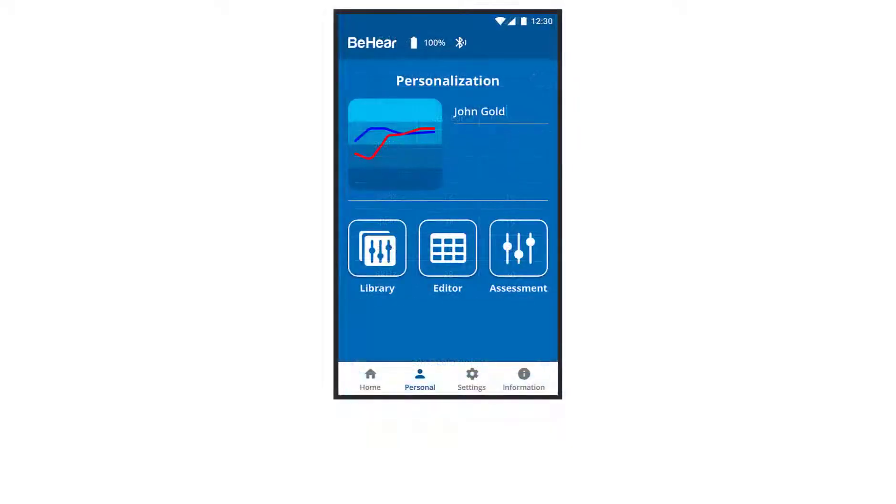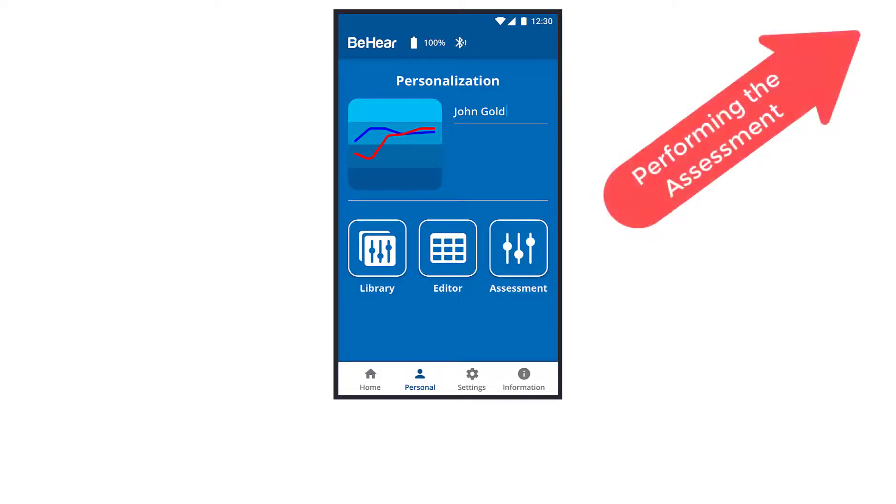Tap the assessment icon to access the hearing assessment, either to perform the test or to review and or edit the results. If you want to learn about performing the hearing assessment, watch this video.